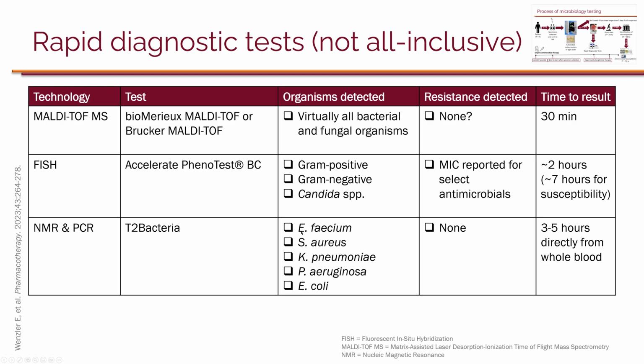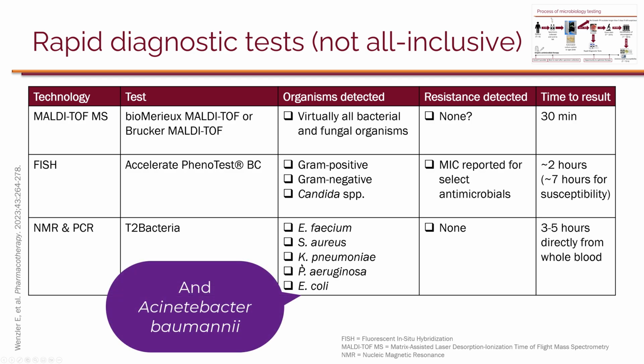However, the caveat, or I should say the downside, is that there's only a limited number of organisms that this can detect. But as time goes on, I anticipate that this test will in time be able to detect more organisms as they research and develop this test.